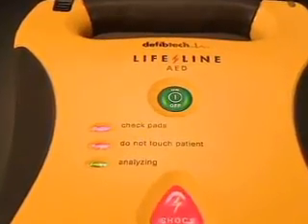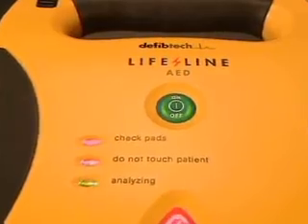The unit will run a complete extended self-test, report its status, and automatically turn off. Be aware that running a manual self-test uses 1 shock's worth of energy from the battery pack.